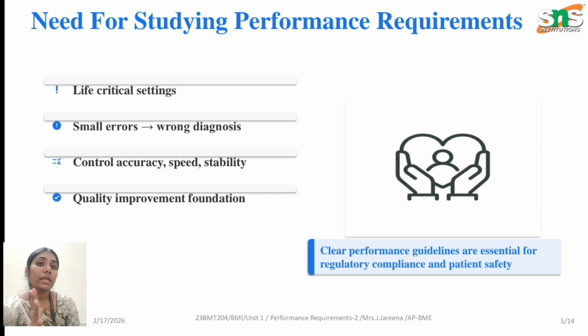Also, there are quality improvement foundations. If you have very good performance, it means the medical device has very good quality, which is very important in order to comply with regulatory standards. So we have to meet these performance requirements to make regulatory compliance easy, so that we can obtain certification to sell the product in the market or use it at hospital sites.